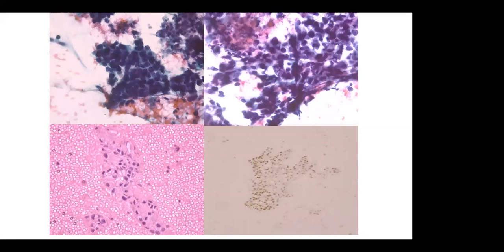Another point, look, I'm showing this cytology to you. Unfortunately here, we cannot do more interactivity to ask you, but you see two aspects of the smears and the cell block. Some cell blocks look brighter, with a tendency to see the cytoplasm as keratinized.